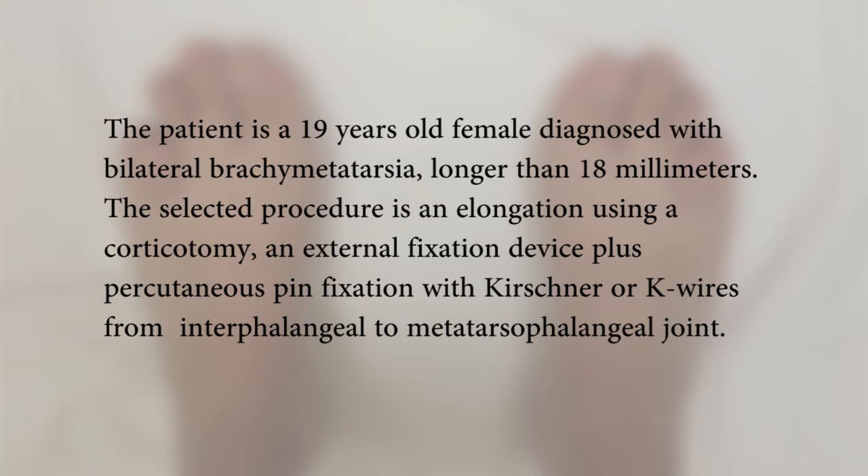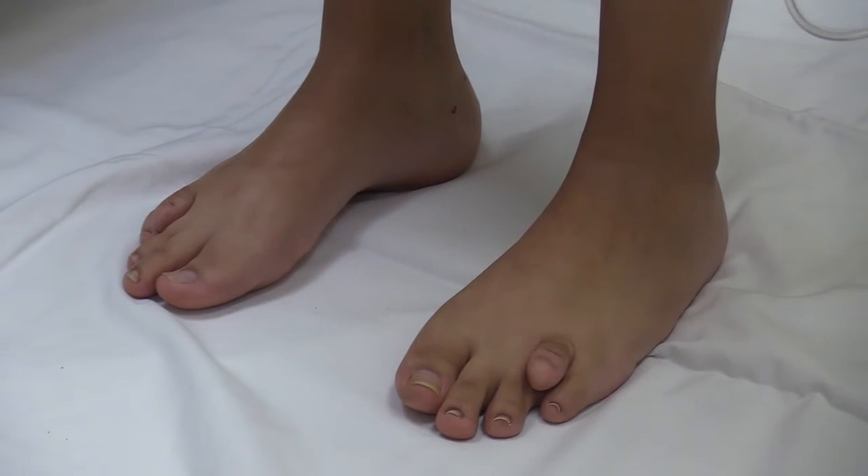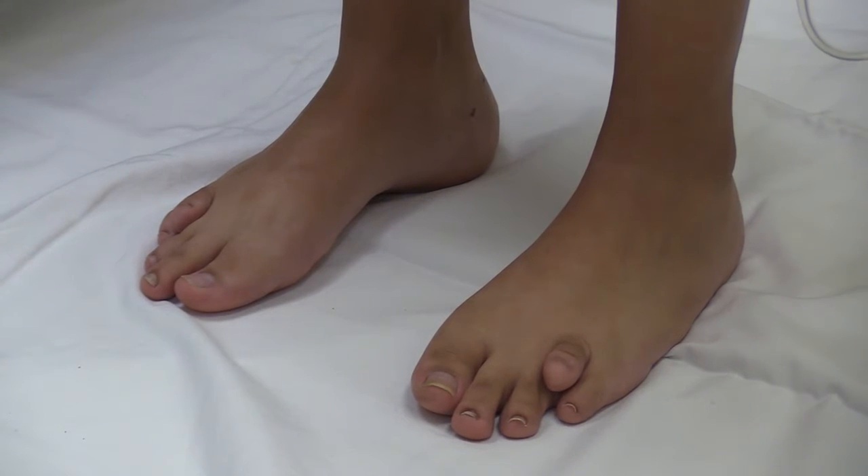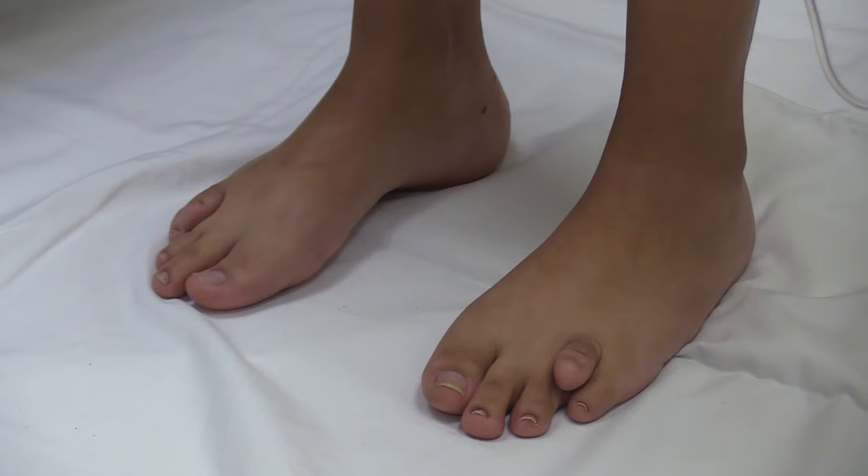A 19-year-old female diagnosed with bilateral brachymetatarsia, with shortening longer than 18 mm. The selected procedure is an elongation using a corticotomy, an external fixation device, plus percutaneous pin fixation with Kirschner wires from the interphalangeal to the metatarsophalangeal joint.